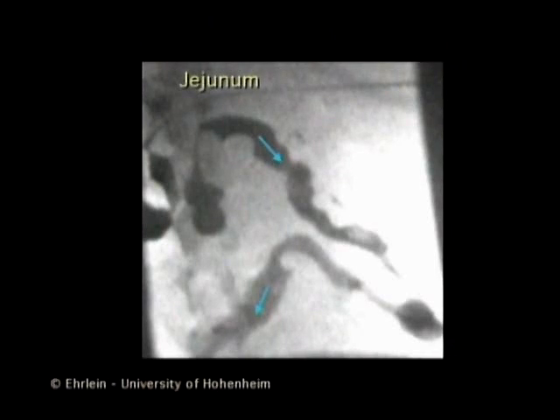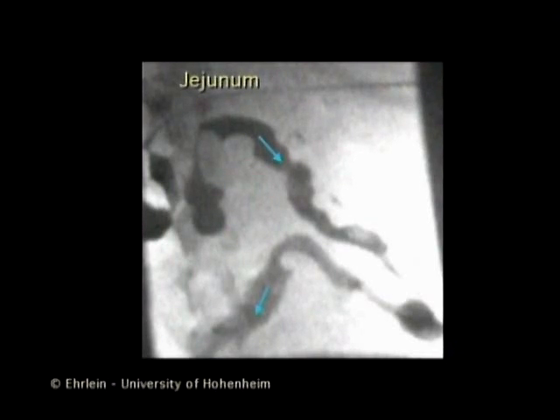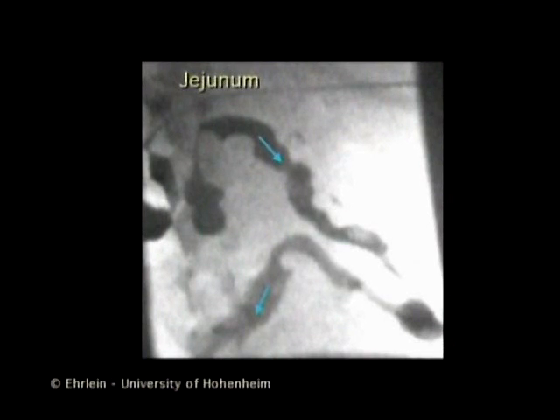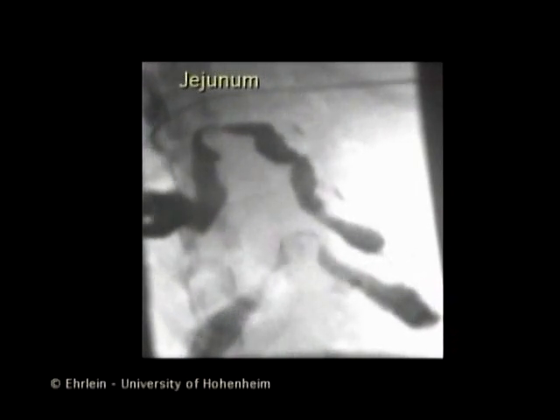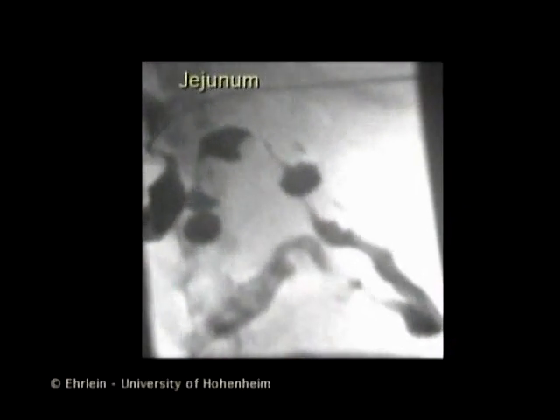This sequence shows segmenting contractions of the jejunum. The arrows indicate the aboral direction of the jejunal loops. Segmenting contractions are characterized by stationary contractions occluding the lumen and occurring irregularly at adjacent sites. They divide the luminal content into segments — it is for this reason that the contractions are designated segmenting contractions.